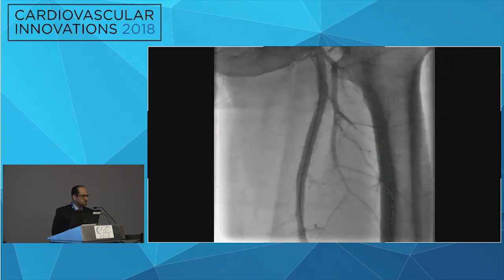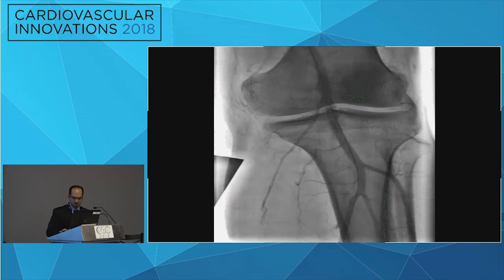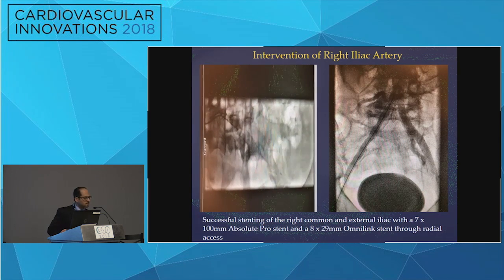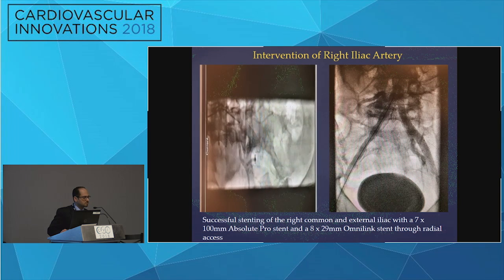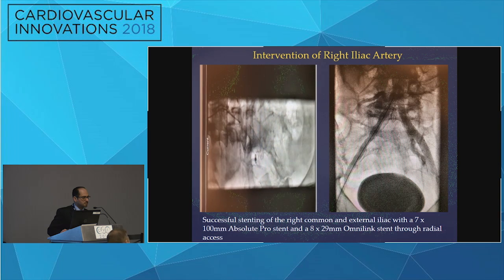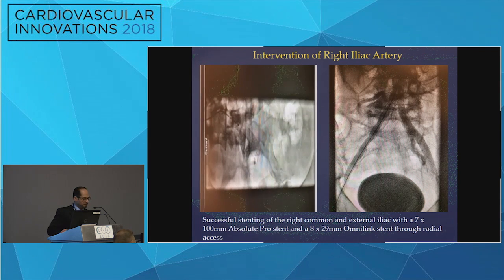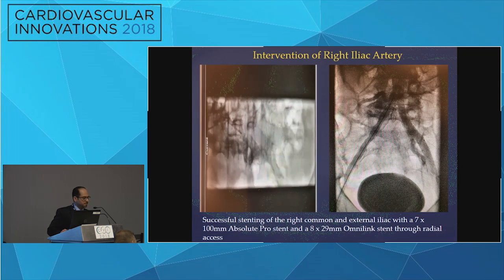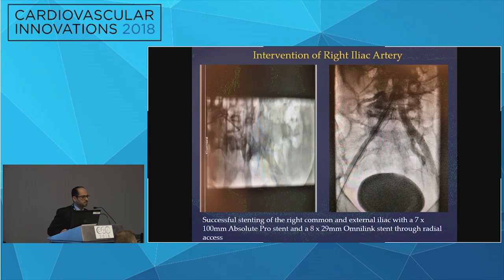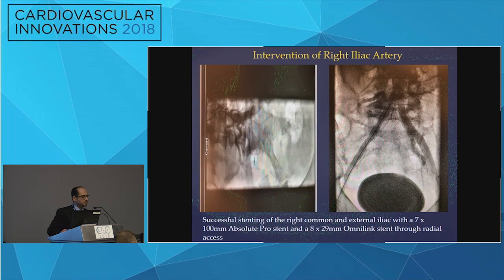I think there was not much of a stump inferiorly in that common femoral, but a lot of times I will puncture low of the common femoral and keep my distances short. I don't know if you considered that, but 035, keeping my distances short. And if I get into subintimal spaces, I try to communicate in the middle. That way, at least I can communicate there. I think it's a safer area.